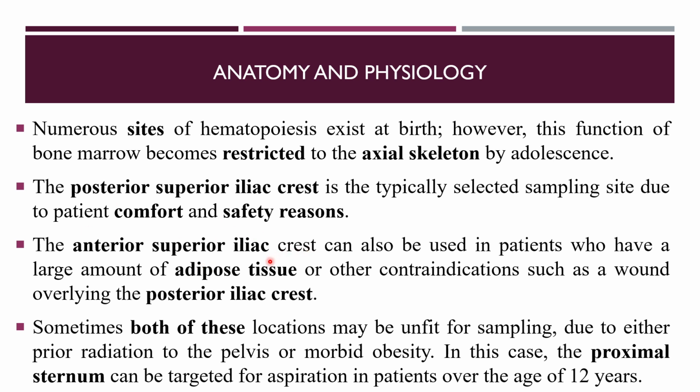There are also exceptional cases in which sample collection is very hard from both sides, meaning we cannot collect the sample from the posterior superior or anterior superior. In that case, we collect the sample from the proximal sternum, and that can only be done for patients over the age of 12 years.